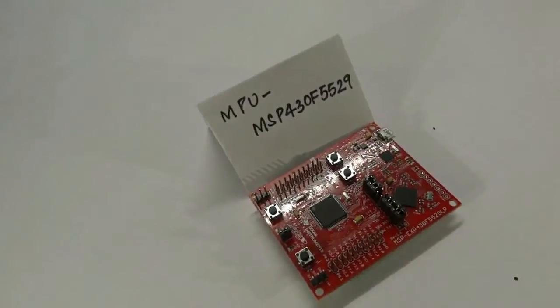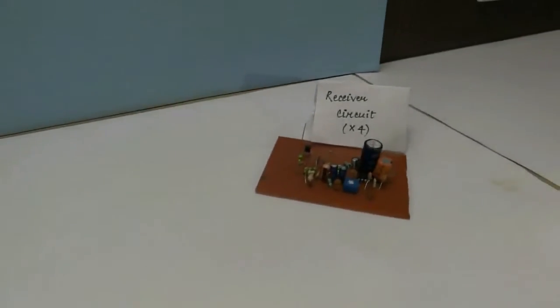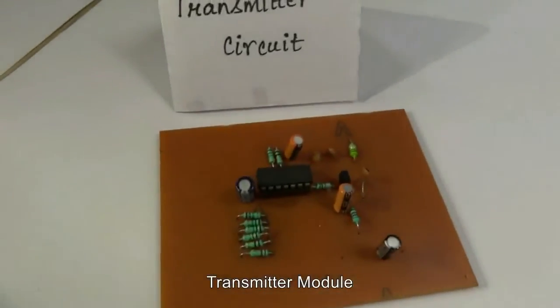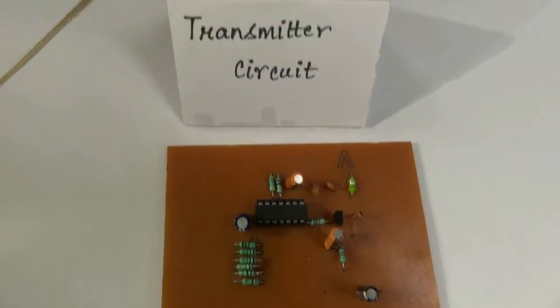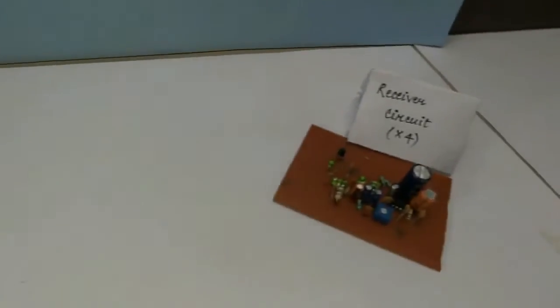The overall project has two modules, the transmitter module and a receiver module. The transmitter module is fitted at the exit point while the four receivers are fitted on the edges of the wheelchair. In case of an emergency situation, the transmitter transmits and the receiver fitted on the chair receives the same.